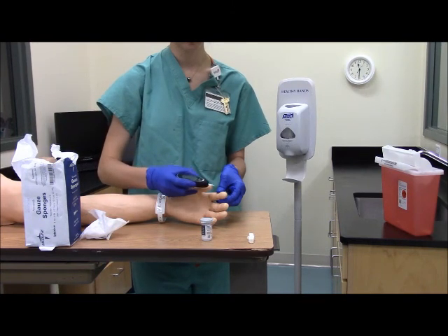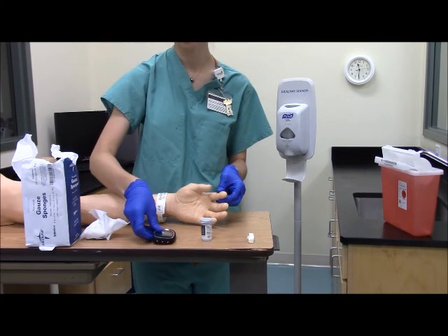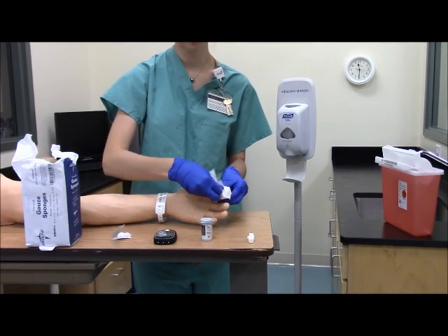You want to gently touch a drop of blood to the pad of the test strip without smearing it. Apply pressure to the puncture site with a cotton ball or a dry gauze — make sure you do not use an alcohol wipe.